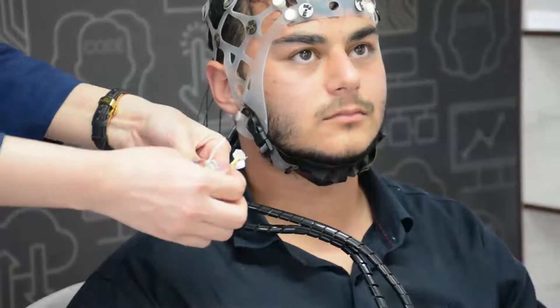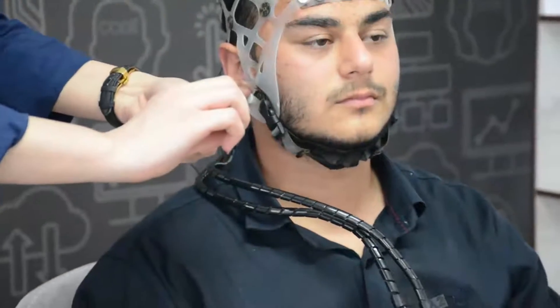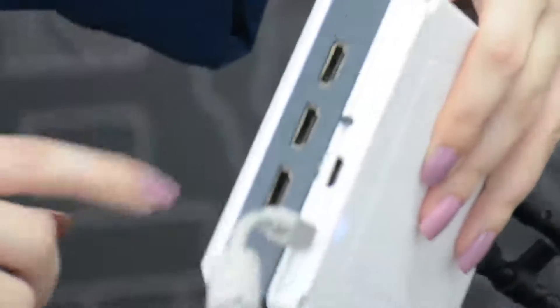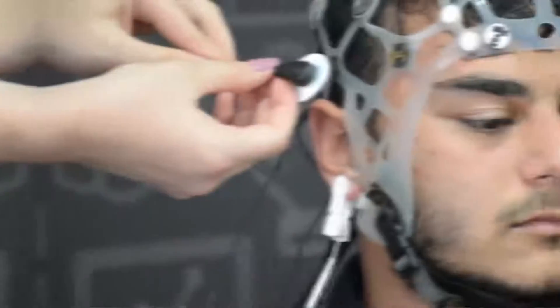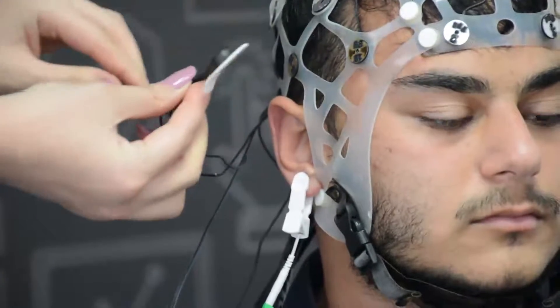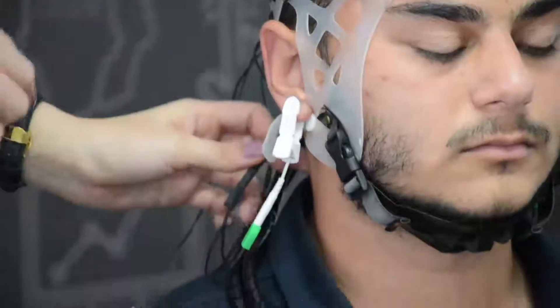You can use the ear clips and connect the reference to the ears of the client. Connect the cap to the device and turn it on. Alternatively, there is a chest lead to have a good connection for the ground and reference.